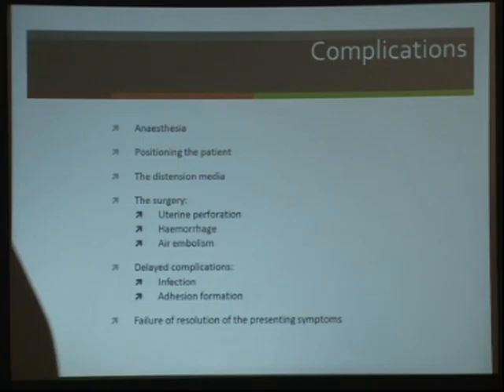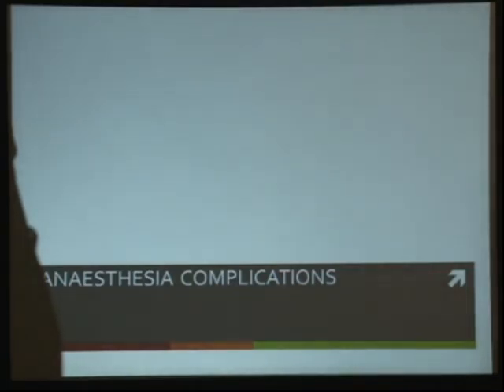So I've divided the complications into the anesthetic complications, complications because of the position of the patient, the distension medium, which was very well covered by Dr. Atul, and the surgery, with complications like perforation, hemorrhage, air embolism, and delayed complications like infection, adhesion formation, and failure of resolution of the presenting symptoms. So let's talk about the anesthetic complications.